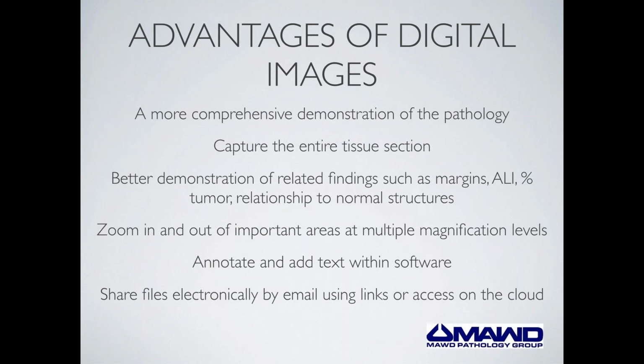I think it would take multiple still images to show the same finding using traditional methods. And in most cases, you probably would not even have taken all those images during your prior review. With digital images, you can show features that were not previously captured in still images, but that were brought up during tumor board discussions. You can share the entire file via email or text using a URL link. It's very easy, and Richard will demonstrate how to do that.